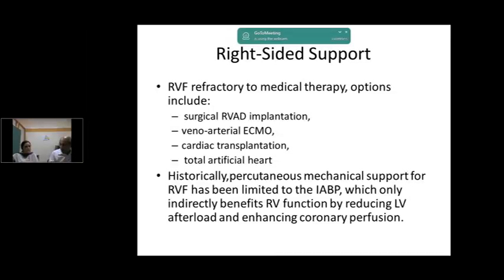There are problems related to them, such as hypertension. Since this is a continuous flow technique, you cannot measure blood pressure in the usual way, so you have to use ultrasonic detection to do that. That has to be seen. Then these patients have arrhythmias. That could be existing, and they may have been on an implantable cardioverter defibrillator. Again, it has to be managed. All these issues are there. These are all about the LVAD devices.